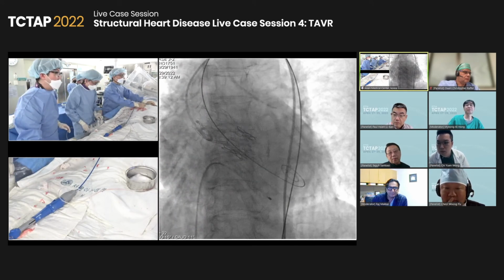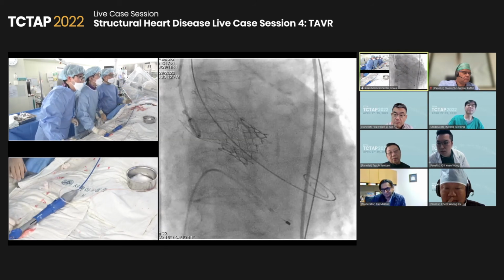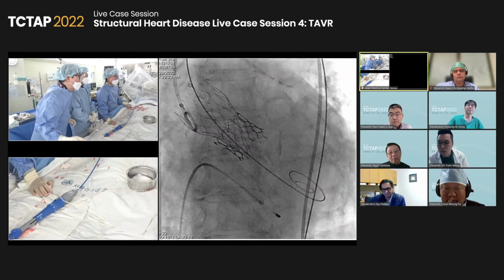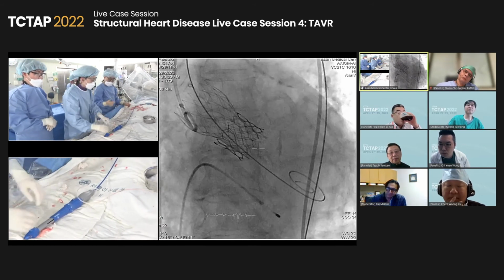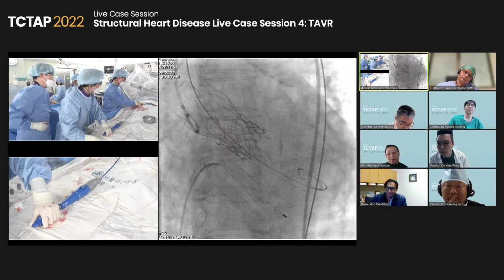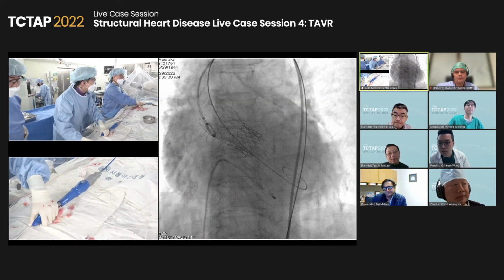Yes. Okay, ready. Test. Let's take a shot here. Yes, shooting. Okay. Shot. Okay, the coronary, I think it's good. And the coronary remove is good. I'm gonna check the monitoring again, simultaneous. Watch it. Yep. 1, 2, 3. Wait, all removed? Yes.